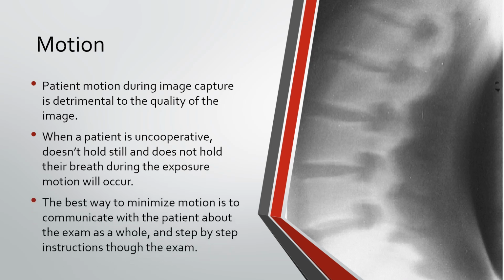Okay, there are ways to minimize that. The best way is to communicate with the patient about the exam as a whole, and give step-by-step instructions through the exam. If we can let the patient know what we're going to do and what to expect, it can calm them down, and it can also make them more cooperative during the exam. So communication is best. Sometimes communication isn't enough.